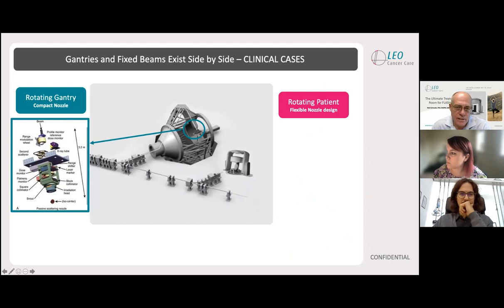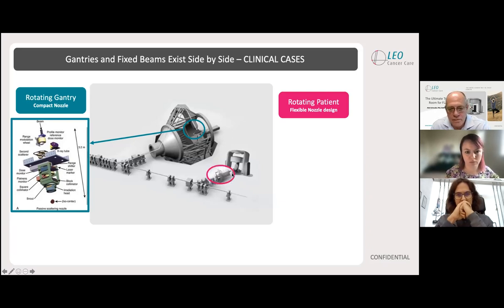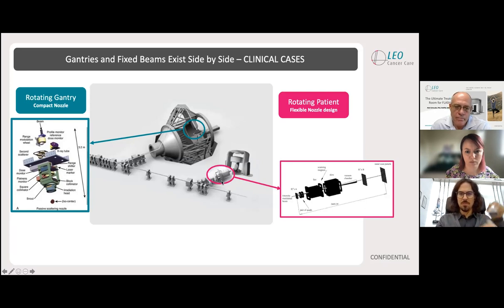And I want to say that whatever I say in the next couple of slides in terms of fixed nozzles is, of course, possible in gantries, but the gantry radius will increase dramatically to achieve what I think we want to achieve in the fixed rooms. But if you look at a fixed beam room, and this is our room of the future, I just inserted the nozzle here. That nozzle is pretty empty. And it's not a problem to shift the isocenter a meter or two downstream, providing you have the room space in the room, and most rooms will give you that space. And then there's not much in a fixed beam nozzle, and you have the benefit, you can increase the distance.